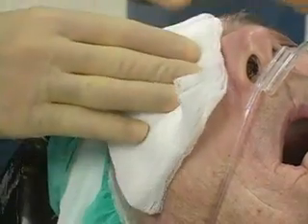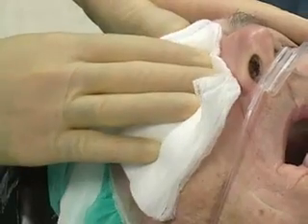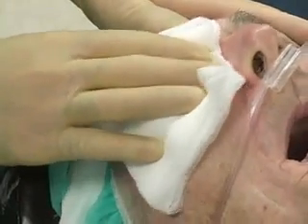If the appearance and tension of the eye are normal, continue to massage the globe for approximately 5 more minutes. This allows sufficient time for the block to take complete effect.